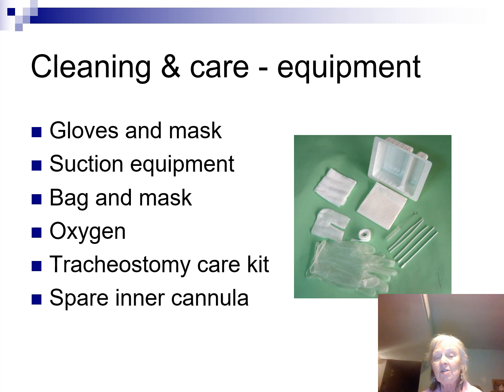Disposable inner cannulas come in a box. The box is labeled with the size of the inner cannula. I'm going to tell you, when you go into a patient's room, one of the things you always want to check for is that there are inner cannulas in that box. Sometimes what's happened, people have used them all up. They just left the box there. Nobody says anything to you.